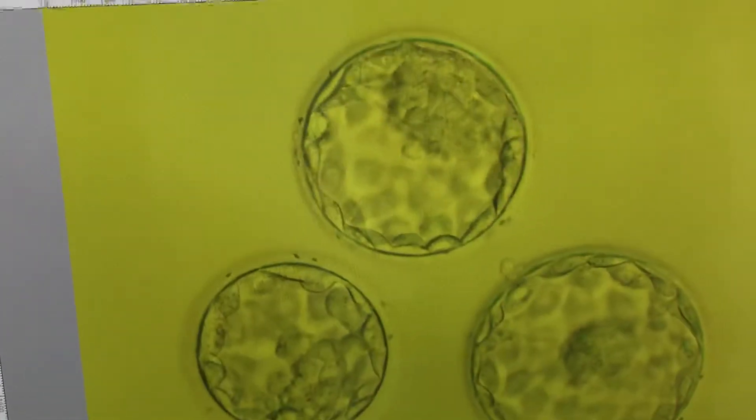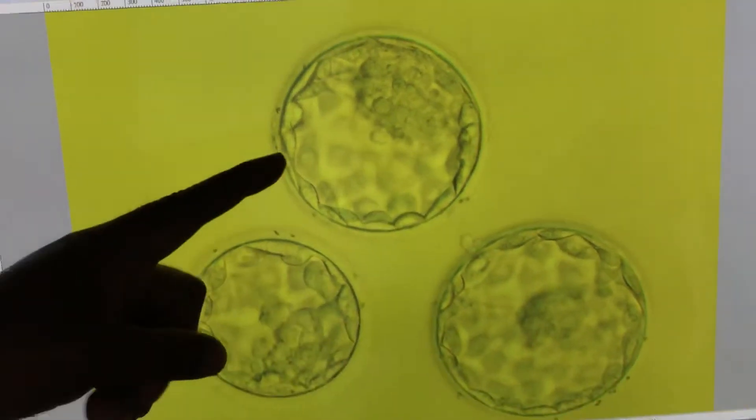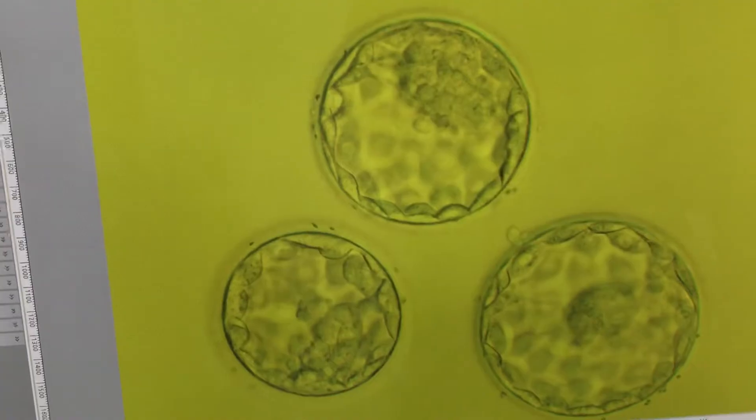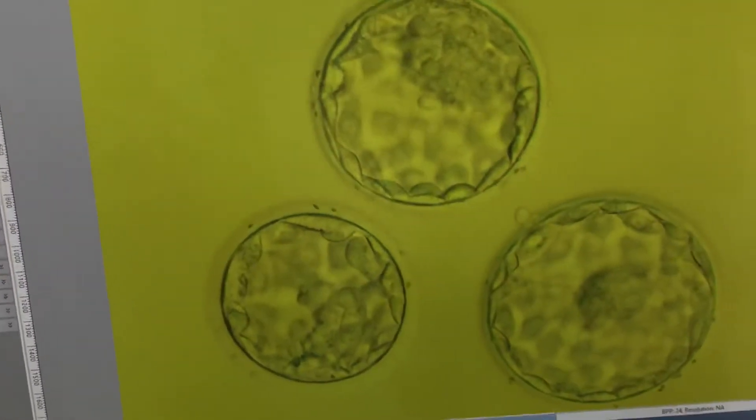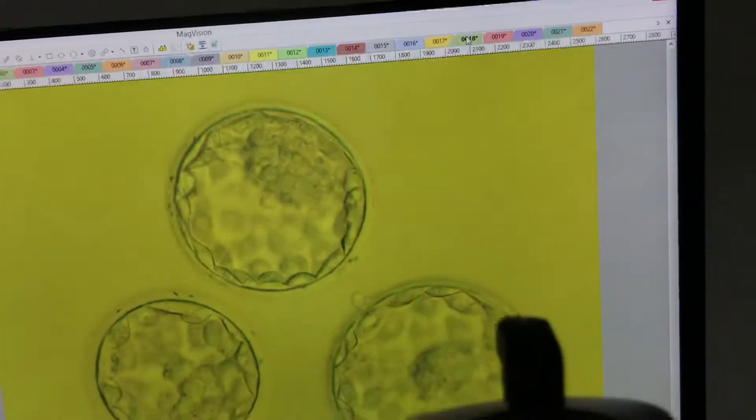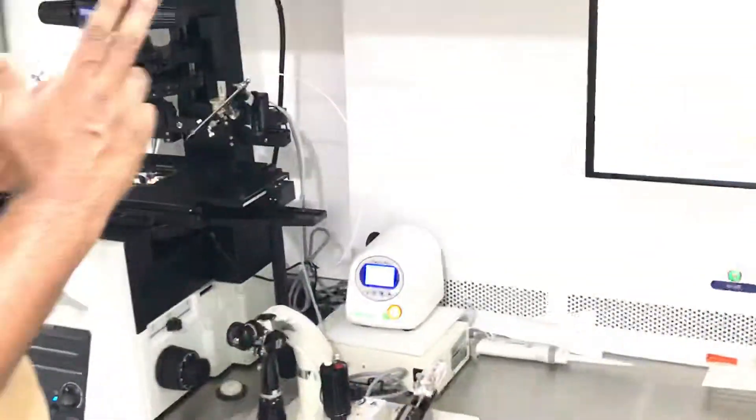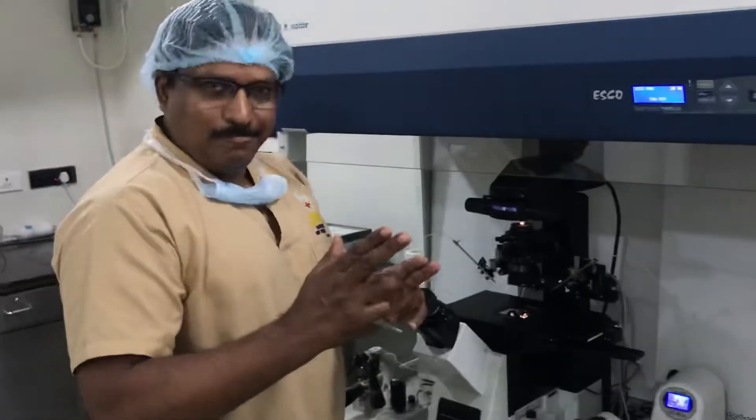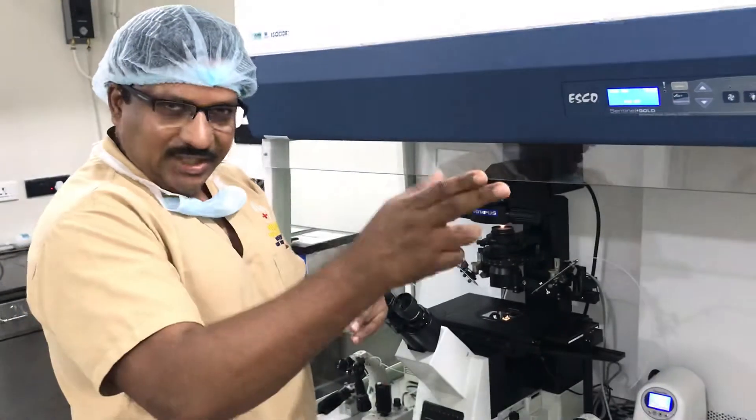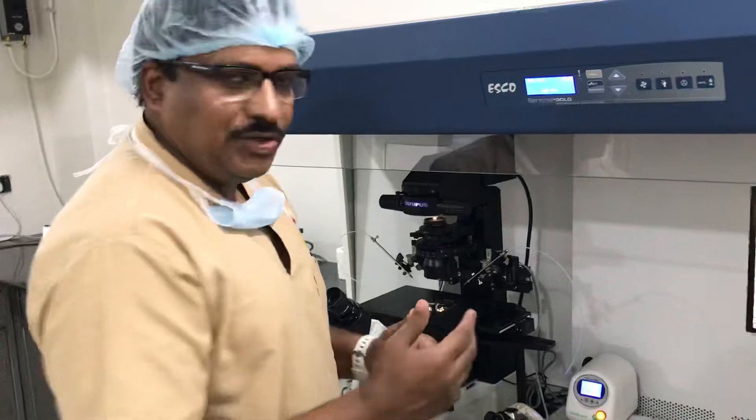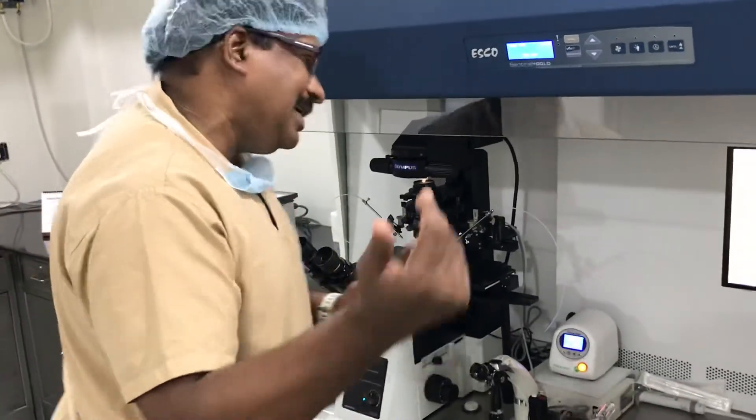And another one - my god, this again looks like fresh blastocysts, it doesn't look frozen-thawed. This is the best. Now I want to show you one blastocyst transfer which is about to be performed. Please come with me.